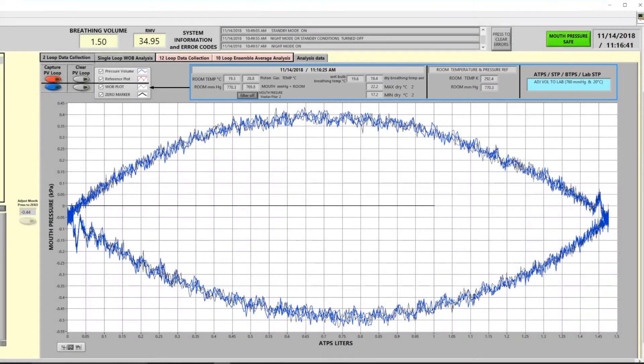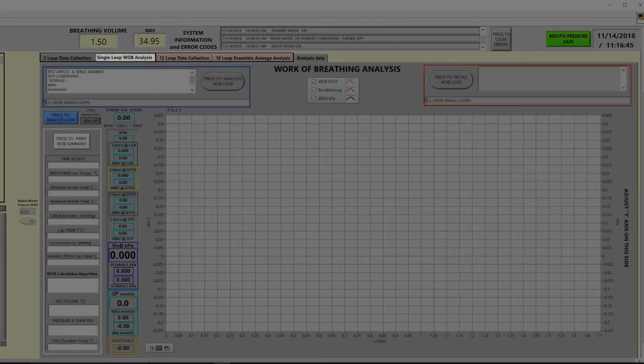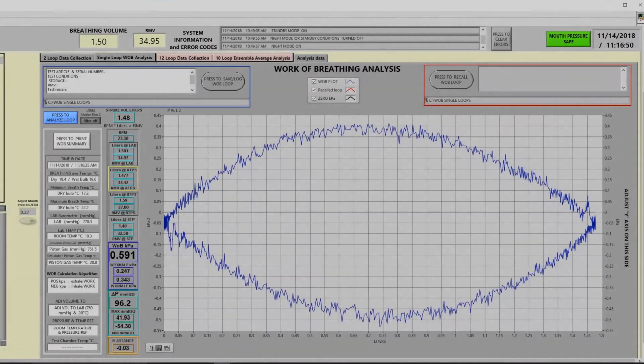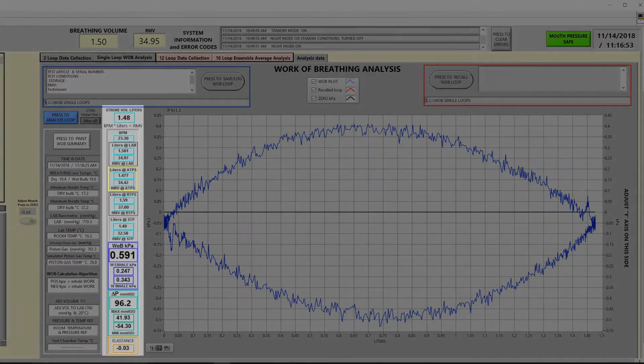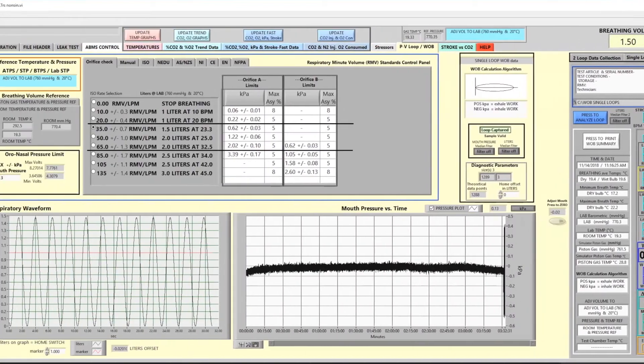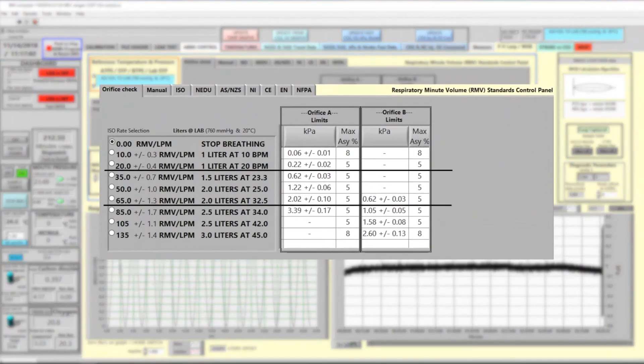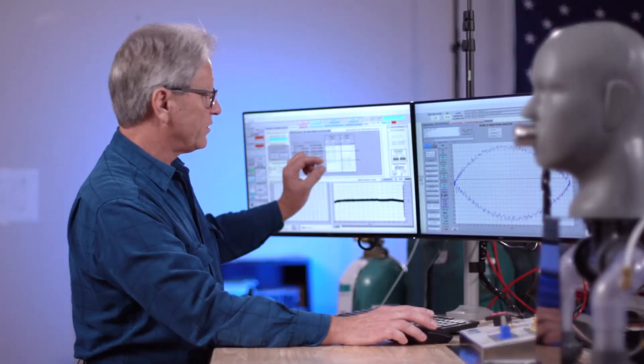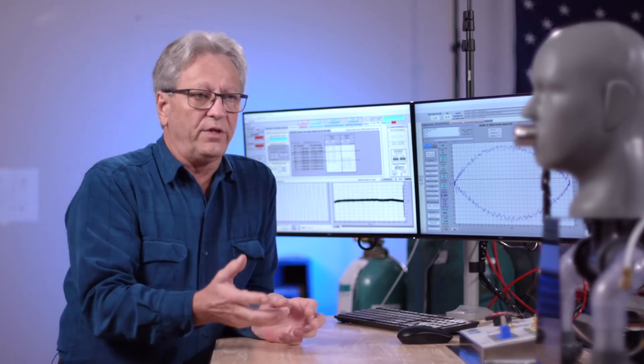Now to analyze this loop, we select the single loop work of breathing analysis tab and press the button to do the analysis. Here we have the tracing and on screen we have the analysis produced by the system which gives us the work of breathing that we can compare to this chart and see that we are within compliance of the variance allowed. Were this not to come in within the parameters, we would know that somewhere within our system we had a leak.